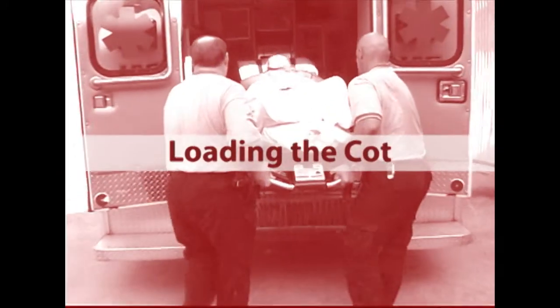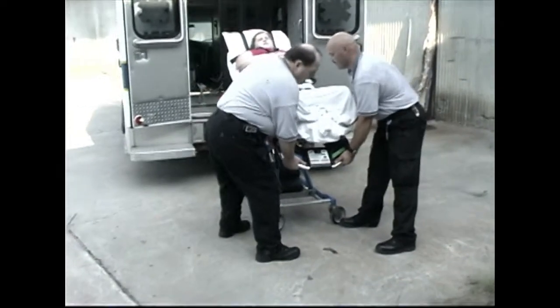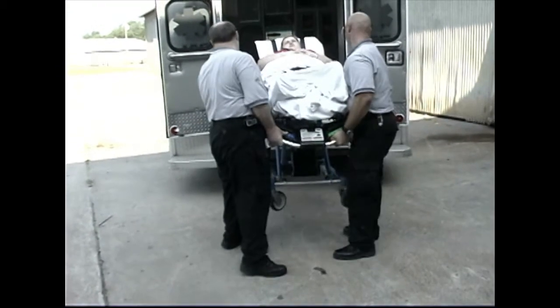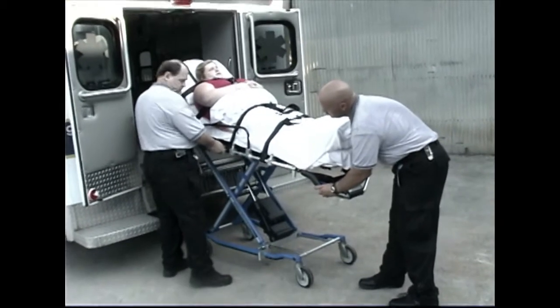Loading the cot. Loading a cot with a patient on it requires a minimum of two trained operators working together. Both operators may stand together at the foot-end corners of the cot while loading it. The cot can be loaded into ambulances with floor heights up to 34 inches.